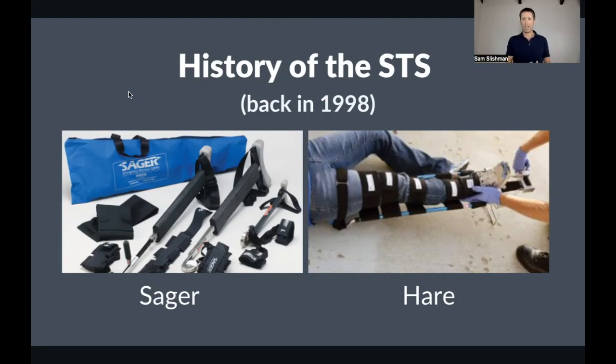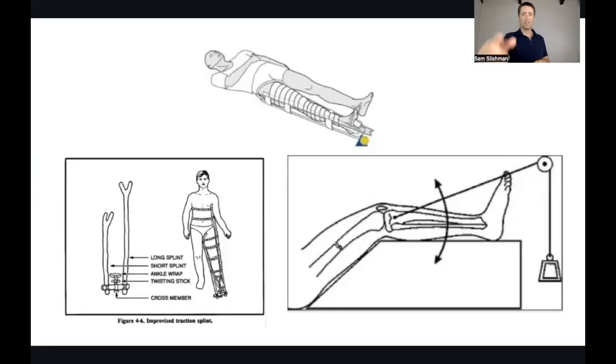The impression that you get from these products is that it takes enormous force to counteract femoral quadriceps spasm. And what I've learned over the years is that's really not the case. But so I went down a lot of different rabbit holes. I thought about types of pneumatic or hydraulic systems, cranks. And eventually, I think my father and I started talking about pulley mechanisms. And so that led to, so here's a slide.